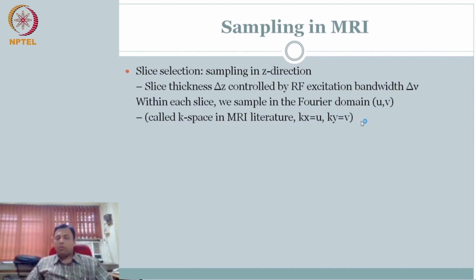This is again the bigger problem in this domain. Each time we think about sampling, we introduce the concept x(t) or y(t), the signal in the time domain, and we say, oh, sample it at twice the highest frequency to beat the Nyquist, and that's how we do the sampling concept. Here it is kind of weird. The signal that you are recording, as we saw, is actually the frequency spectra. So what you are recording is a sampled version of your frequency spectra. That's where the confusion may start to arise. So in each slice, the data that we acquired is sampled k-space, or sampled Fourier domain is what you have.